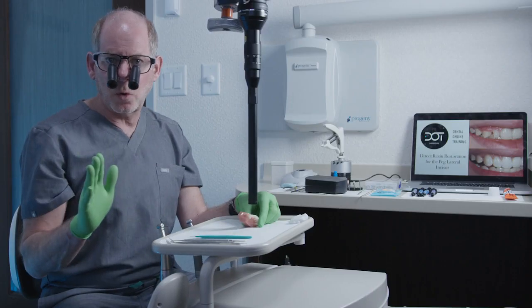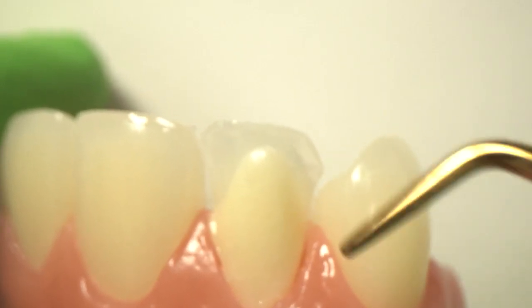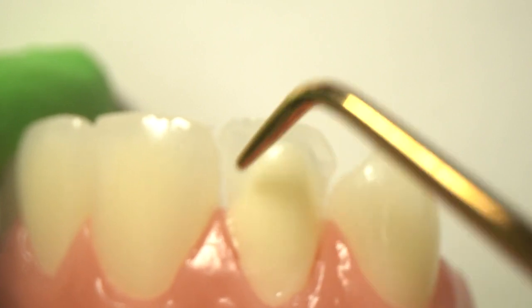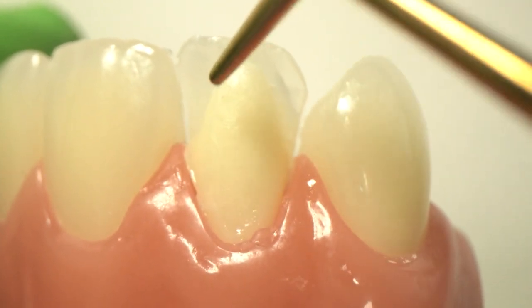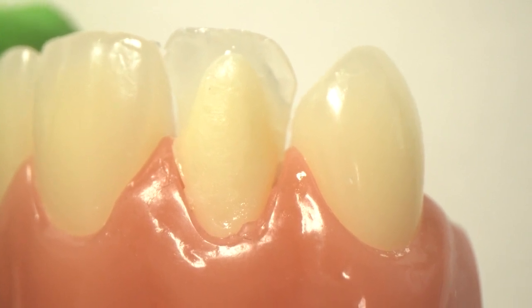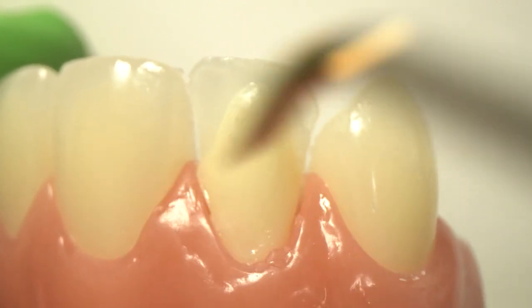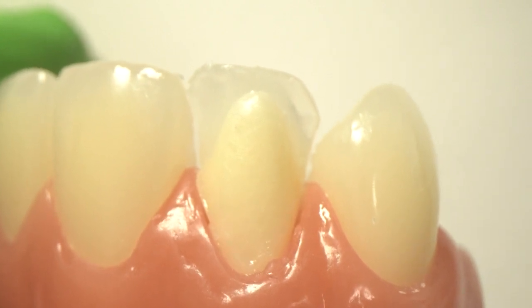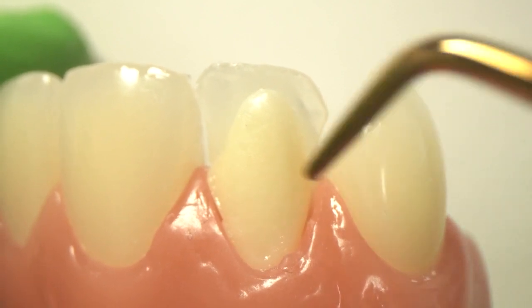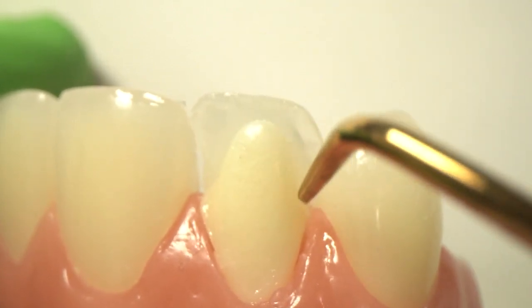Now that we have that palatal wall built, if you take a look at your tooth, you're going to see where the peg portion — the pre-tooth — is, and where we added the composite. If we were just to add more translucent material in this zone, it would be too translucent and you'd be able to see through and see the shape of the peg. What we need to do is create a more natural tooth form and build those mamelons, like what we saw when we were looking at the central incisor. For that, we need to use our dentin shade — our body shade — which is the A1 Hybrid. We're going to add A1 Hybrid to the mesial and a little bit to the distal to create the proper tooth form.